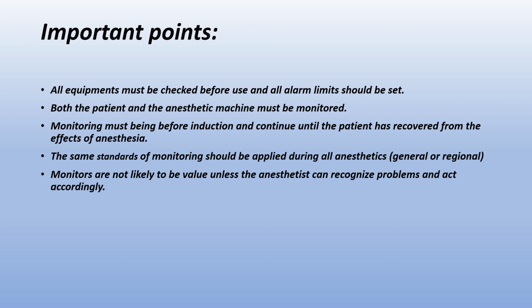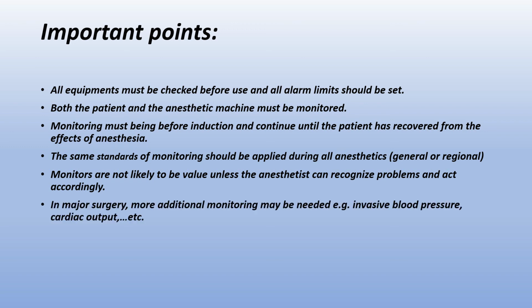Monitors are not likely to be valuable unless the anesthetist can recognize problems and act accordingly. In major surgery, additional monitoring may be needed, for example invasive blood pressure monitoring or cardiac output monitoring.